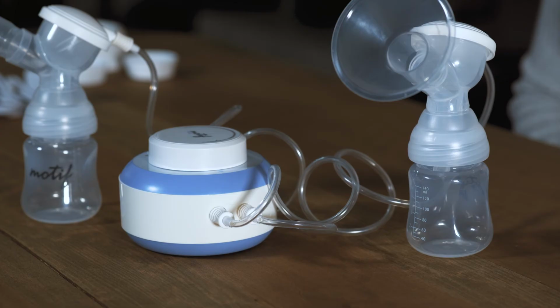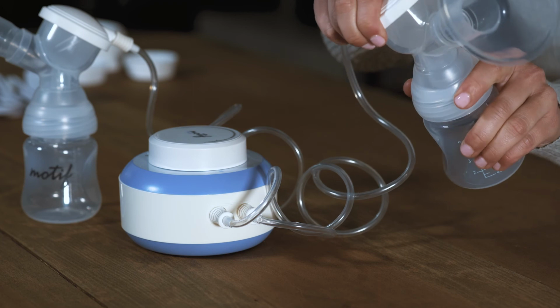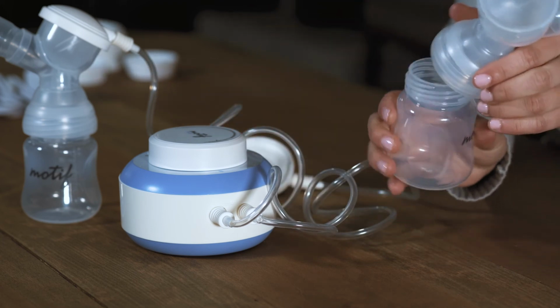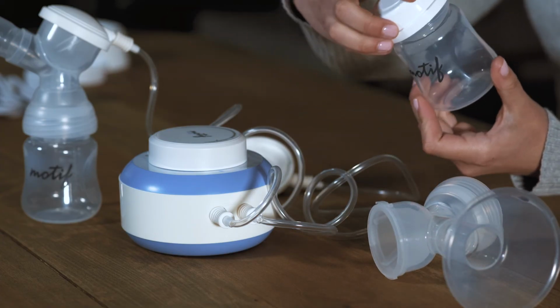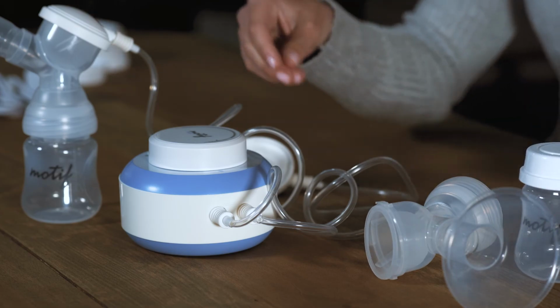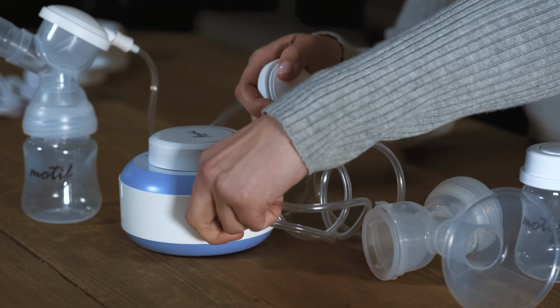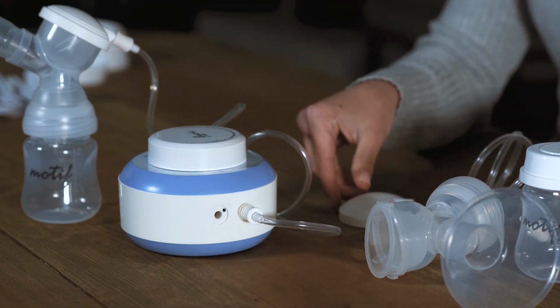Once you have completed your pumping session, be sure to disassemble the pump kit entirely to clean and store after each use. To do so, simply twist the diaphragm assembly off the breast shield. Then, remove the breast shield from the collection bottle and close the bottle tightly with the bottle cover and bottle disc. Finally, remove the tubing from the diaphragm assembly and breast pump. Once disassembled, be sure to clean and sanitize the breast pump parts properly after each use.